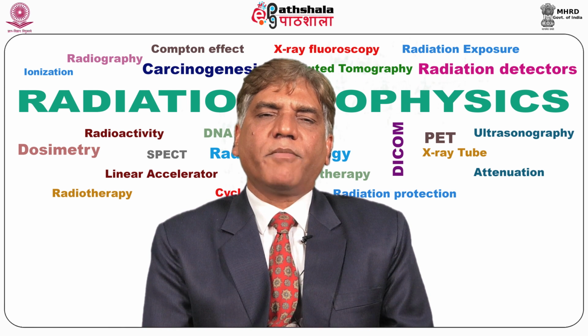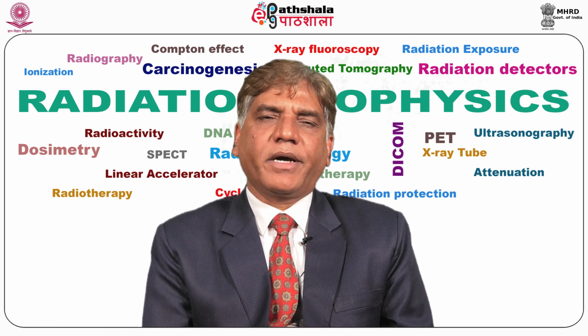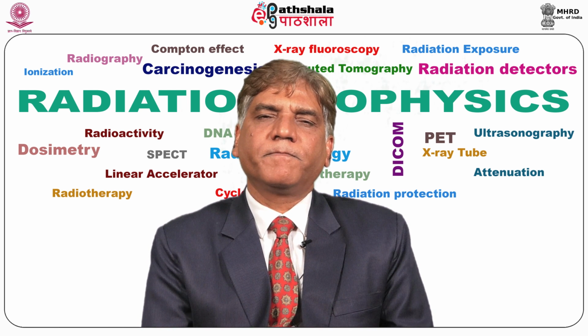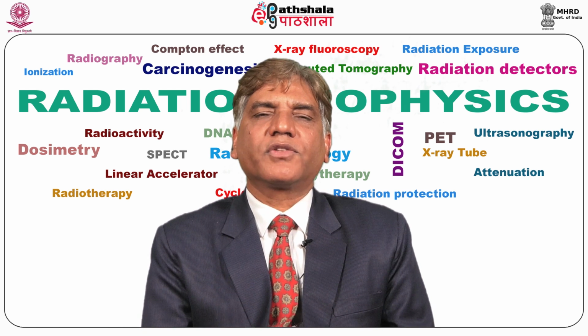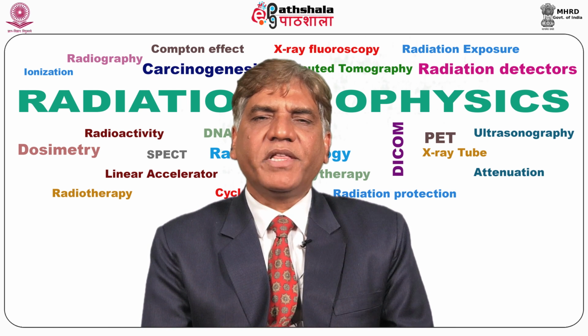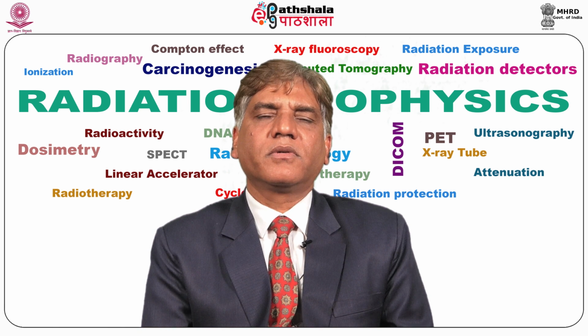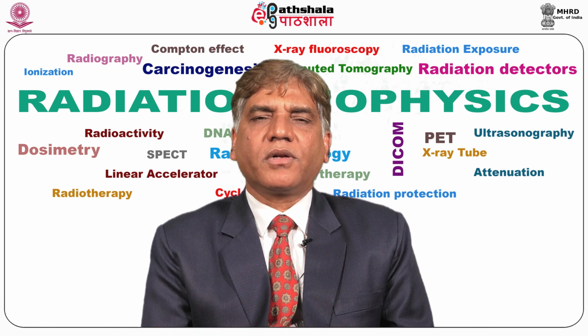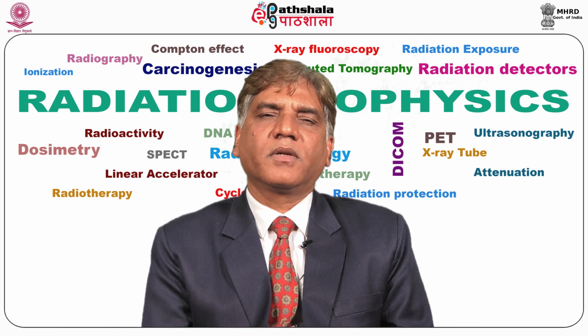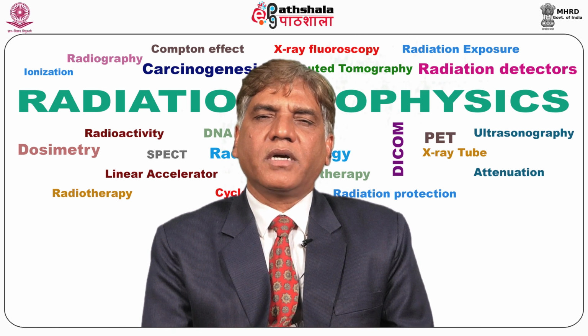Now coming to the components and architecture of PACS. It is defined as a system that typically acquires, stores, transmits, displays and processes digital images. The basic components can be separated into acquisition, for acquiring and pre-processing of images, an image acquisition component is needed.